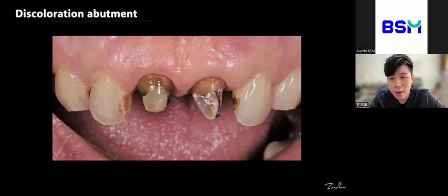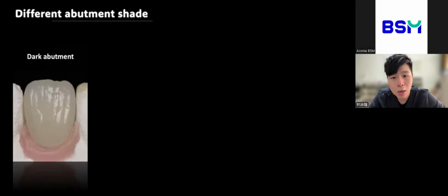I've actually tried many different approaches, even used white zirconia without any masking layer and only relied on prosthetic build-up. It's very difficult to block the background color within just 0.5 to 0.6 millimeter of space. Here you can see when zirconia is placed on a dark abutment, the dark background clearly shows through, right? This not only lowers the value, but can also reduce the chroma.